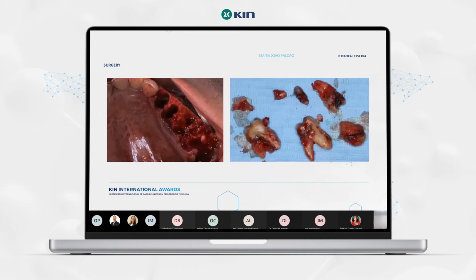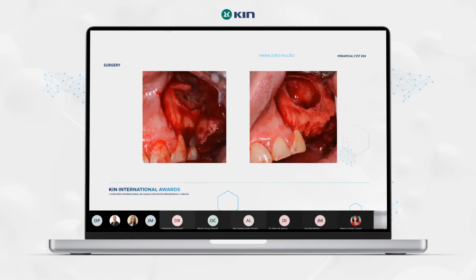First of all, we started to remove all these teeth in the posterior and do some alveoloplasty in the bone so we can have space for our future treatment, that will be implants, but I will talk about that later. We extracted the roots and then opened a flap. When we opened the flap, I accidentally damaged the capsule a little bit, so a little of the content of the capsule came out.